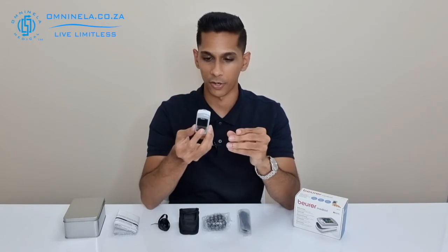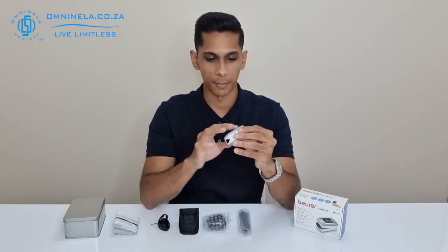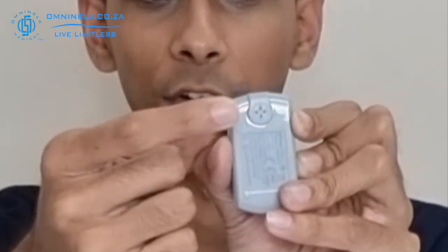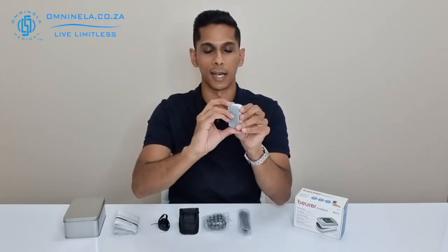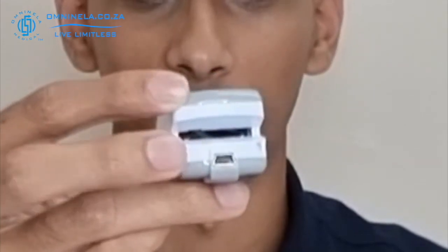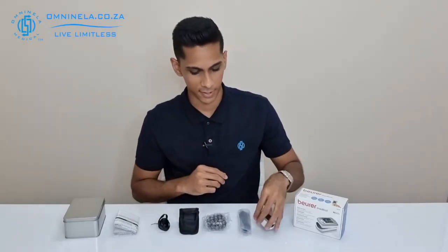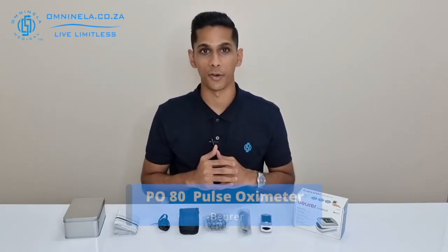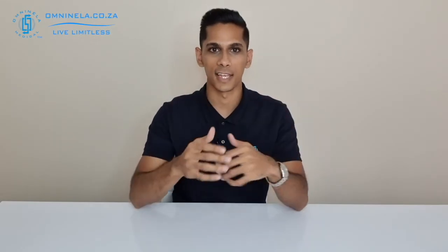On the back side you're going to have the alarm speaker and also the USB input, which will allow you to transfer data back and forth. So that is the PO80 from Beurer.